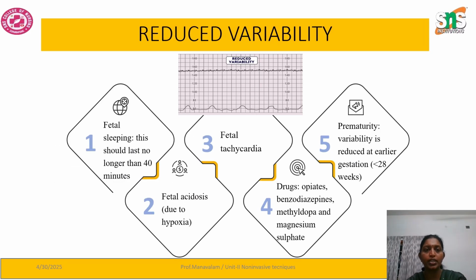In which cases will the variability be reduced? While the fetus is sleeping, there is a chance of reduction of fetal variability. Fetal acidosis also happens because of fetal hypoxia.